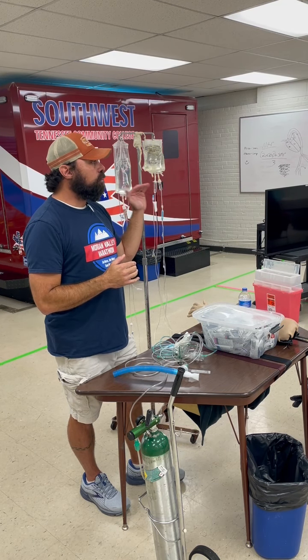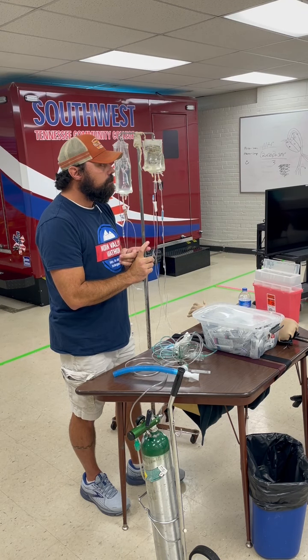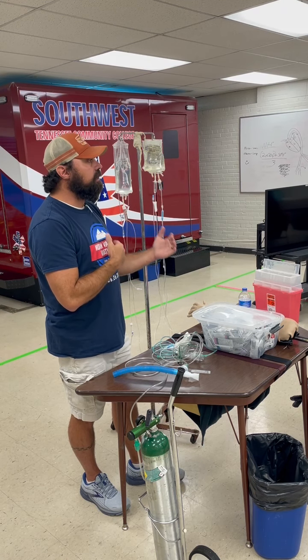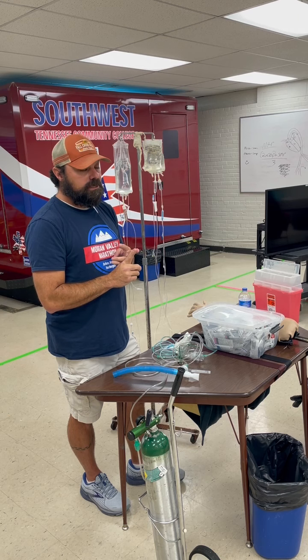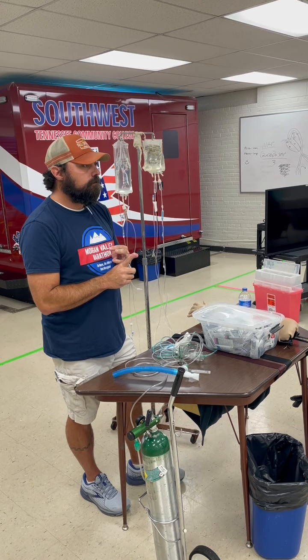Give me some examples of a patient that might need a nebulizer. An asthma patient, obviously. What did you say? Patient that has like pneumonia and wheezing and needs relief. Okay, so wheezing obviously is one of the key indicators. That's an assessment that we would find. What types of disease path? What are we looking at? So asthma's one. Allergic reaction, right? COPD. So, COPD patients, absolutely. What else? What about CHF patients, right? What about just bronchitis, right? That could trigger some inflammation.